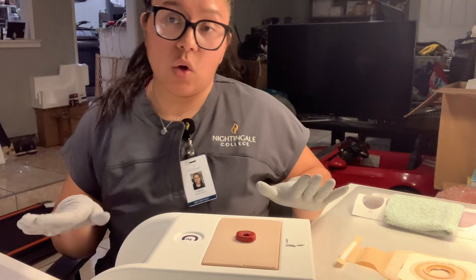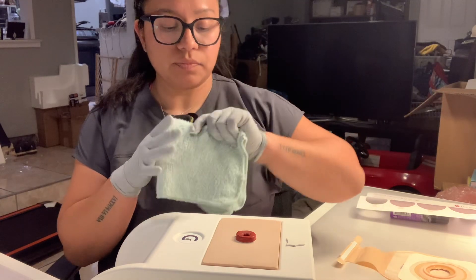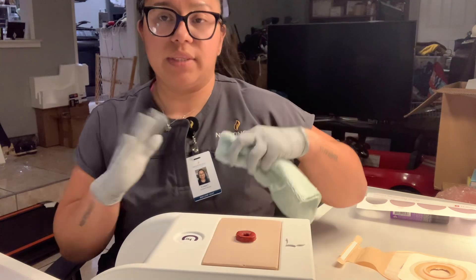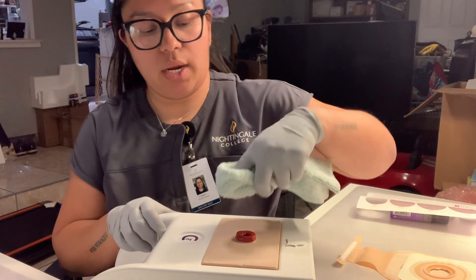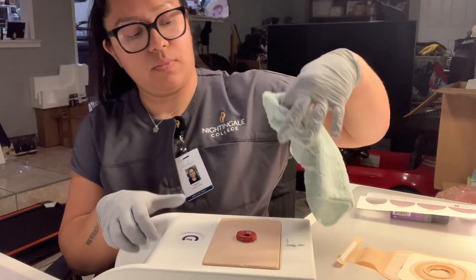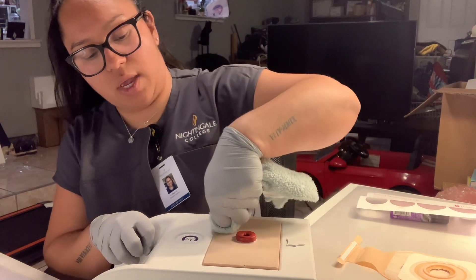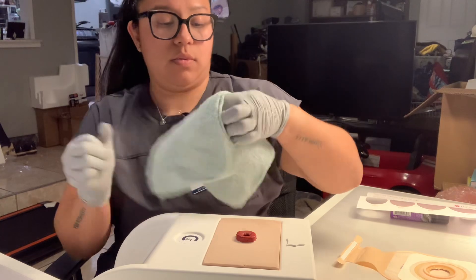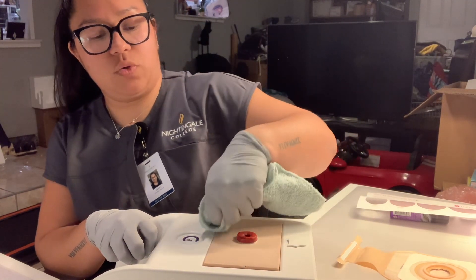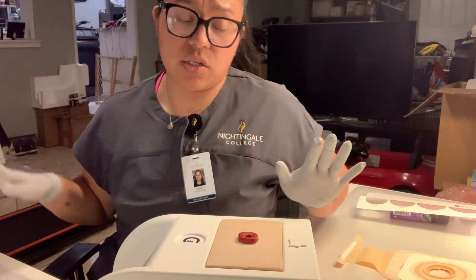Now we're going to go ahead and pat dry with a dry washcloth. Same thing — we're going to use a different corner and go from inner to outer, but this time we're going to pat the area dry. So from inner to outer, using a different corner each time. The area is now patted dry. We're going to go ahead and discard those washcloths.